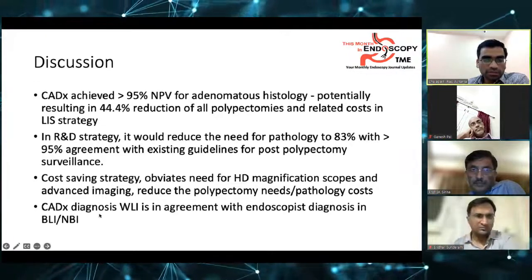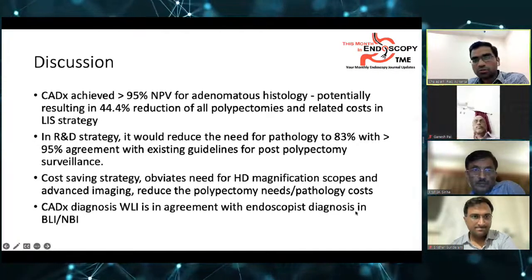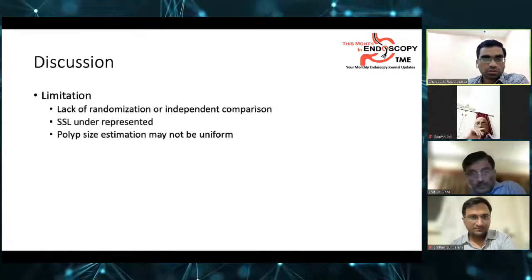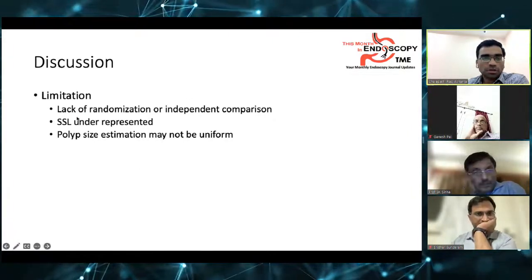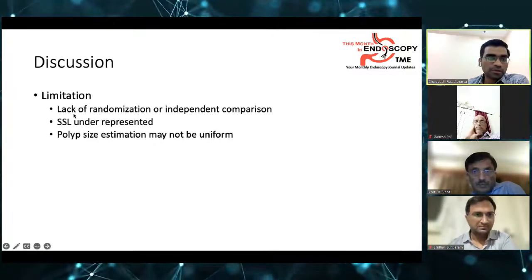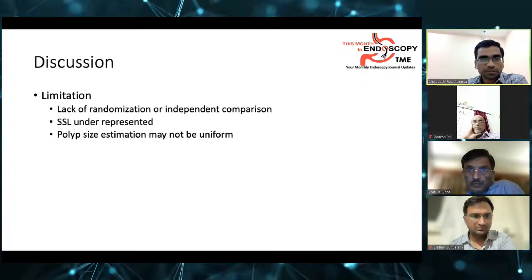And CAD-X, more importantly, diagnosis using just white light endoscopy is in agreement with the endoscopist diagnosis when he or she has used the virtual chroma endoscopy. But the limitation is there is no randomization or independent comparison between the groups, sessile serrated lesions are underrepresented, and the polyp size estimation may not be uniform in all these patients.